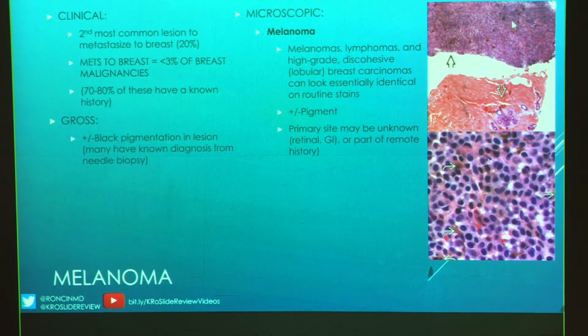And here we can see the lesion, here is normal breast tissue, so the stark contrast between the two. Basically, these are lesions that don't like to make themselves missed.